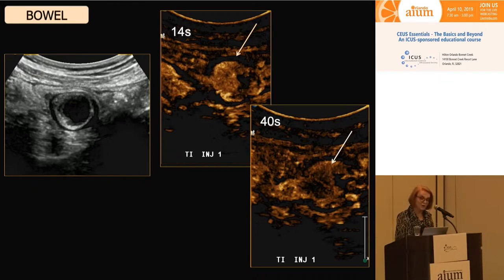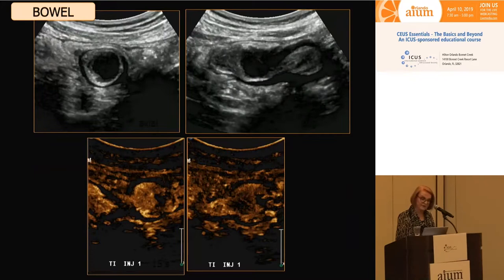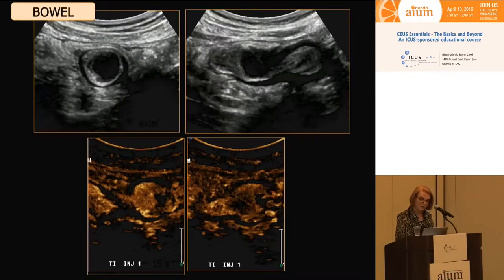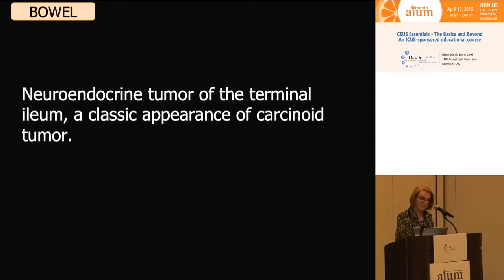We do contrast enhancement and can see that the mass is hyper-enhancing at 14 seconds and washed out by 40 seconds. I think it looks like a neuroendocrine tumor and the contrast enhancement makes me think this is malignant. This is in fact a neuroendocrine tumor of the terminal ileum — a classic appearance of carcinoid tumor — and this is a malignant tumor.